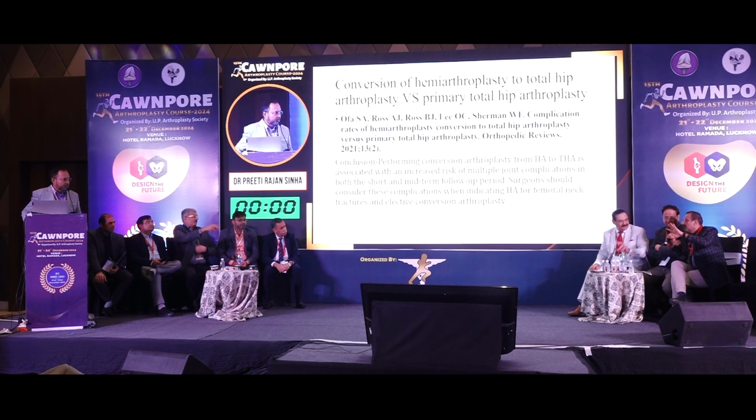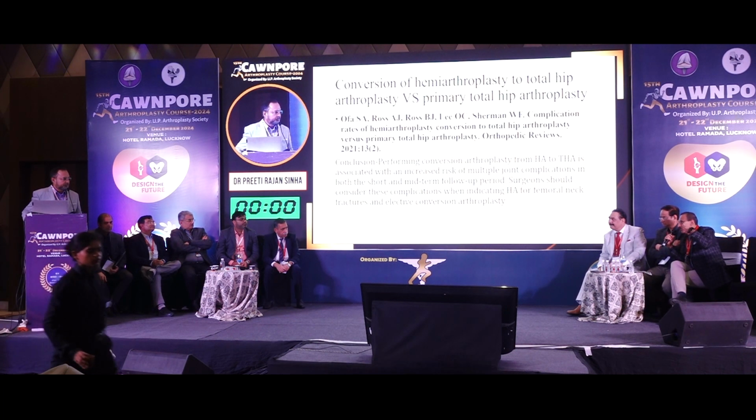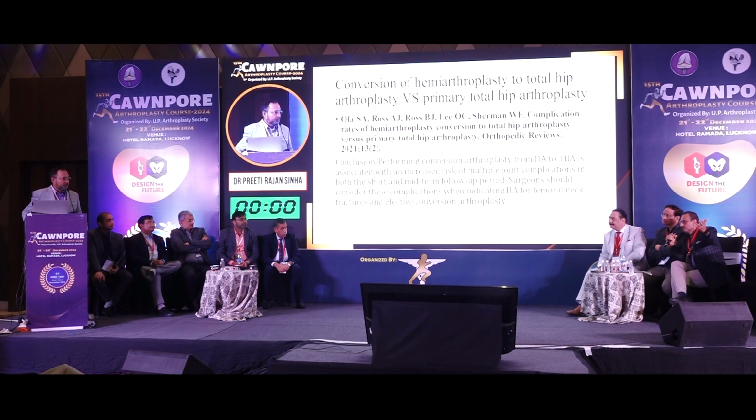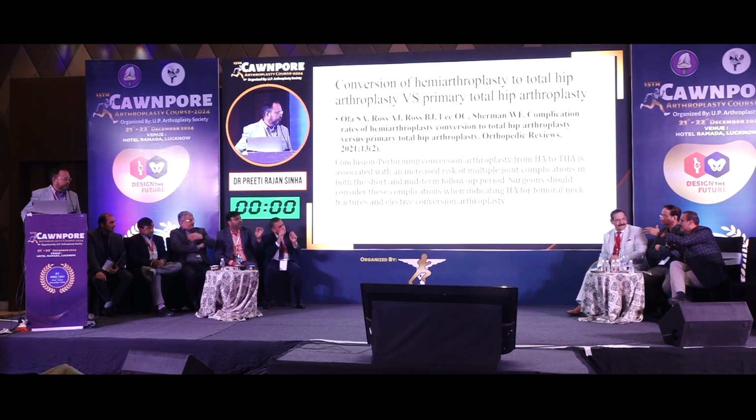The message is, if there is any bone, what is your treatment plan at that time? If you have bone inside and it is difficult to hammer it out, then what will you do? What could be the message of that? Sir, I will be prepared for an ETO. You go straightforward for the ETO? Yes.